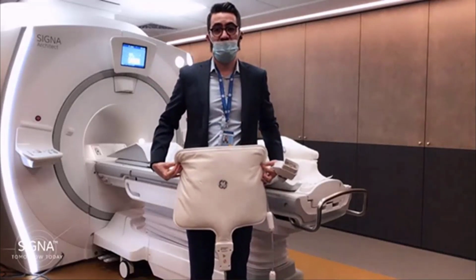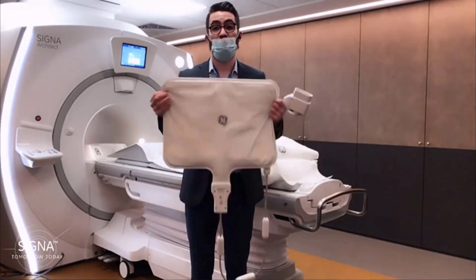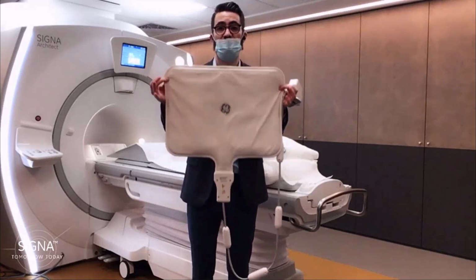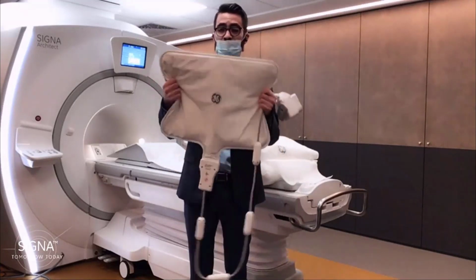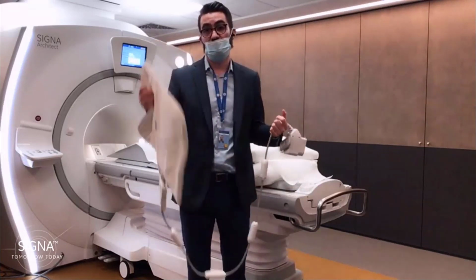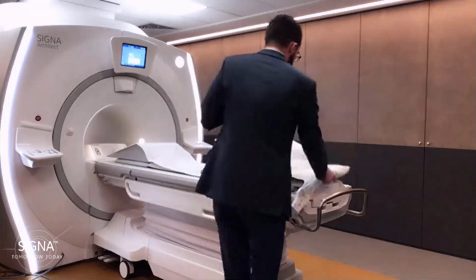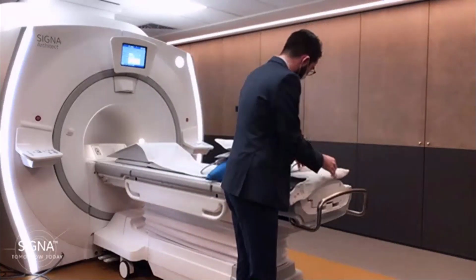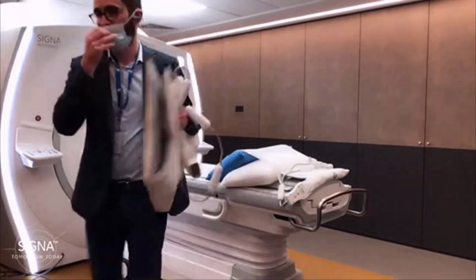And for pelvic examination, or for rectum or prostate, this will be a great coil to use. We'll use it for cardiac as well. So I think now it's time to take our volunteer in the room and install him with the air coil.